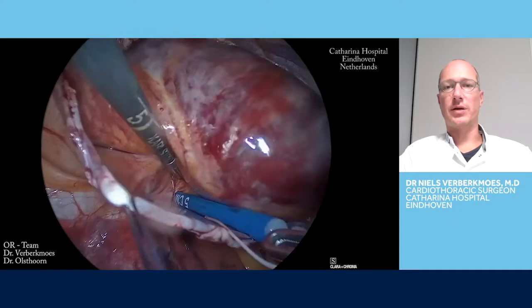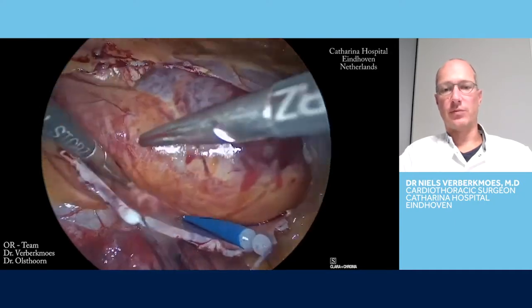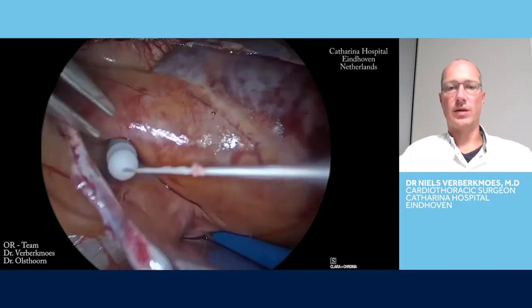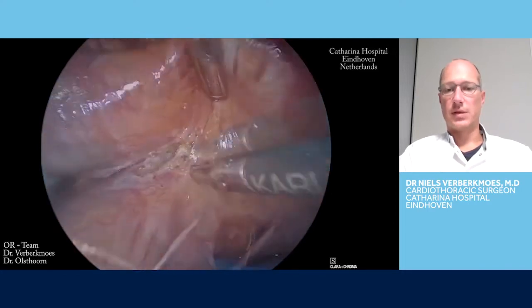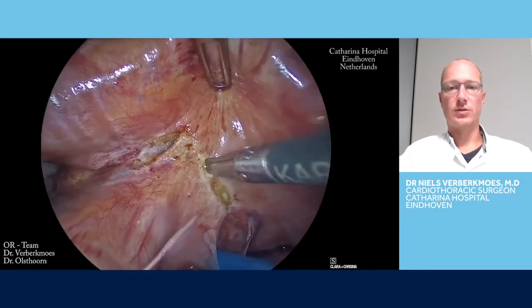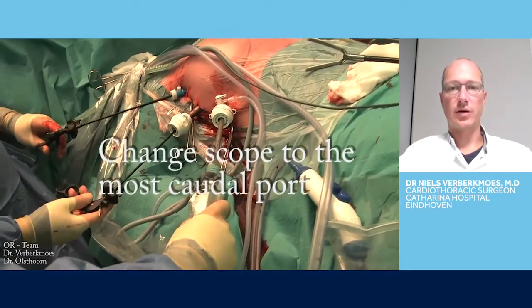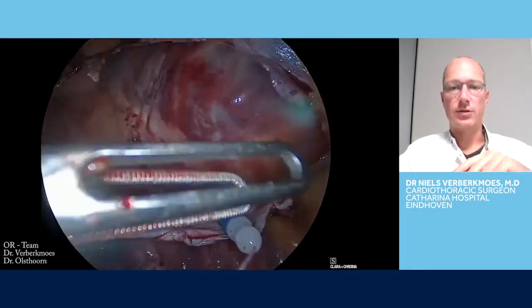We pick up the guiding, the blue guiding, and we pick up the gray guiding. And then when they are outside of the thoracic cavity, we connect the Dzemali S clamp. Here we are opening the groove of Waterston, which is not really necessary because you can ablate, but this is my personal opinion, and I like to have it open, but in the beginning it could be very dangerous.